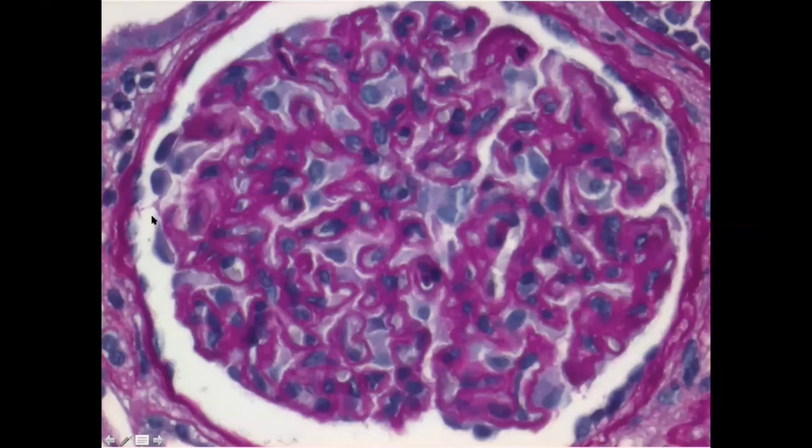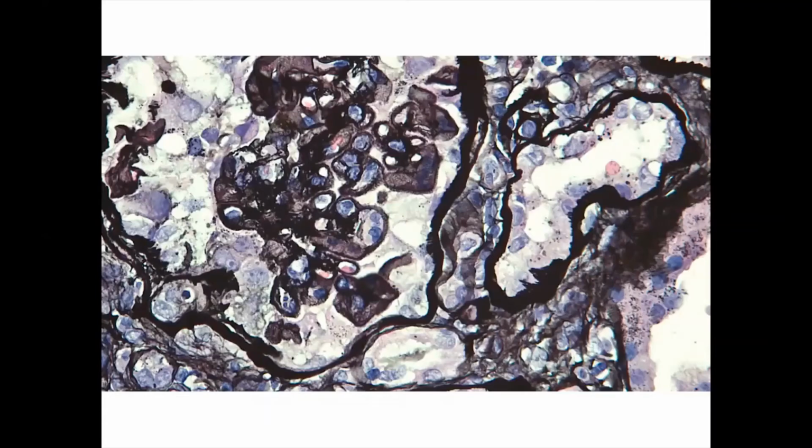These podocytes are upset by something underneath them. It might be deposits. And this is our Jones silver stain, and basically we have the spikes on the surface of the glomerular tufts.